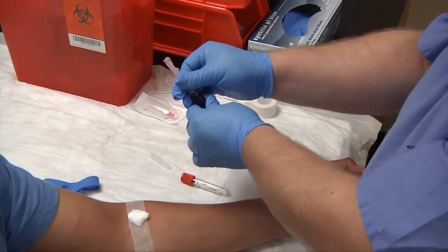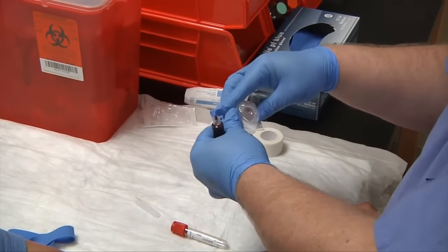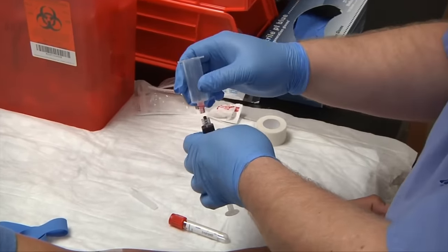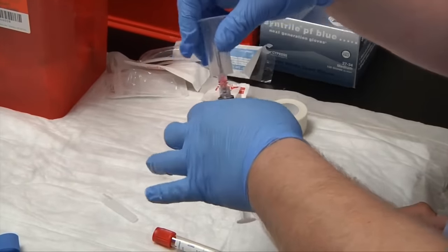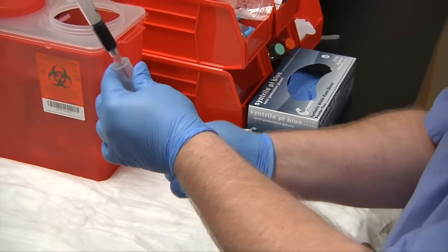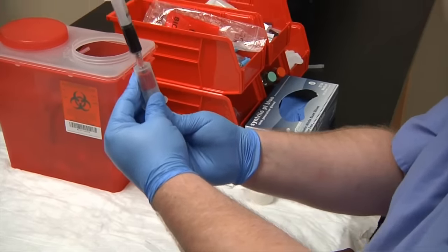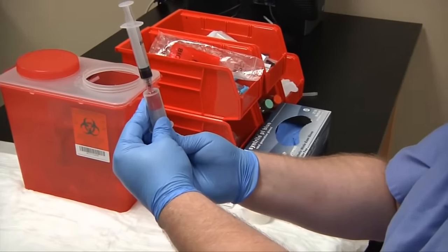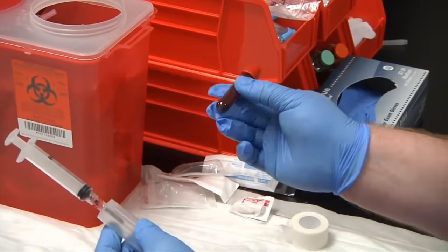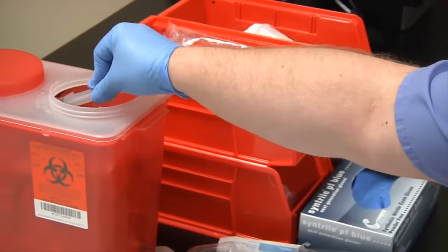Very carefully, unscrew the safety cap needle and dispose of it in the biohazard container. You'll need your transfer device — make sure it is also in date. Attach your transfer device; it screws in just like the needle. Turn your syringe upright and insert your tube from the bottom. Make sure you face the label away so you can see when the tube is done collecting. Gently press in and let the vacuum do the work. Then disengage the tube and invert three to four times. Discard the assembly into the biohazard box.